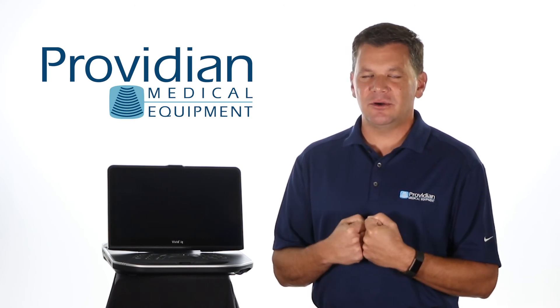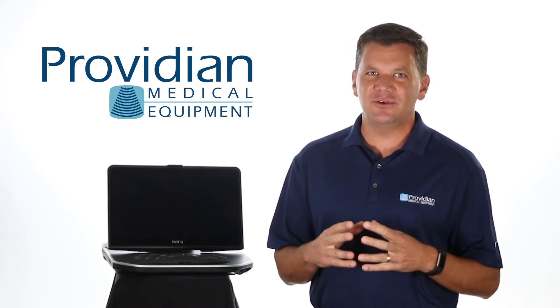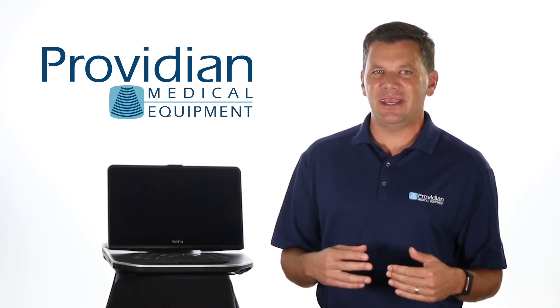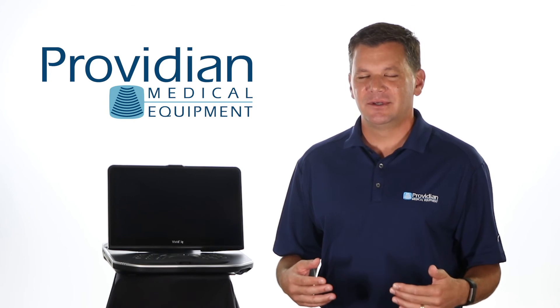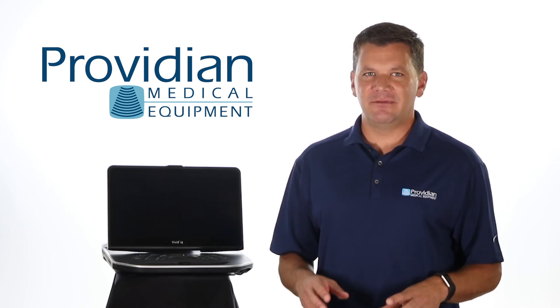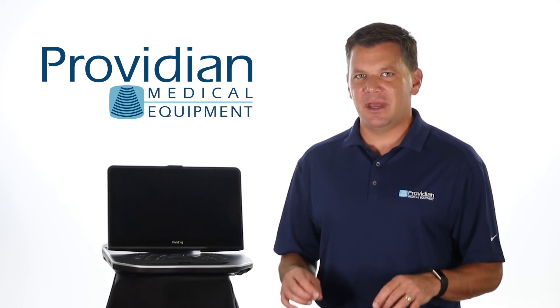The Vivid IQ uses some new terminology for common functions where you find yourself searching and searching for a feature, only to find it's been named something else or is hidden behind one of its many panels. To help with this, I've created a free training series on the Vivid IQ on the Providian Medical website.